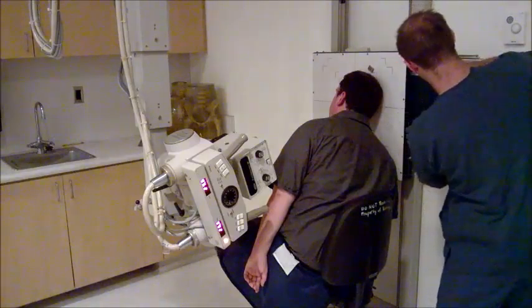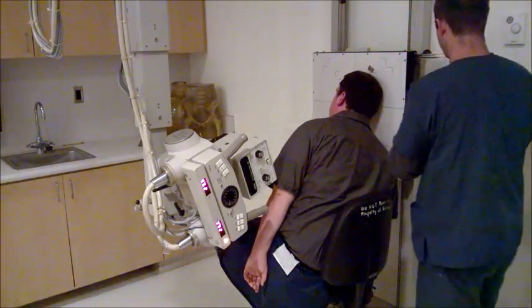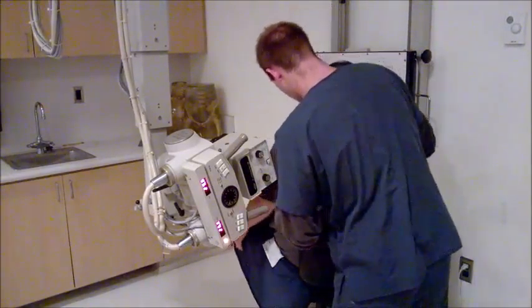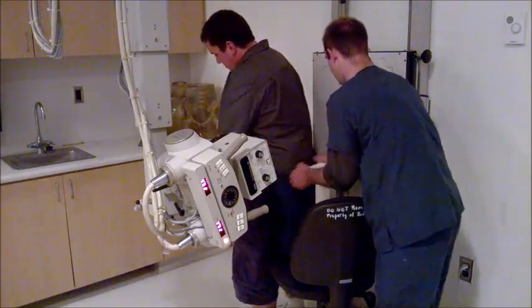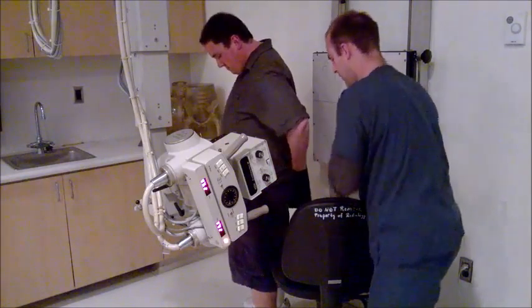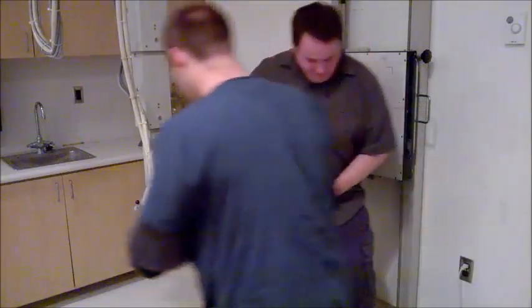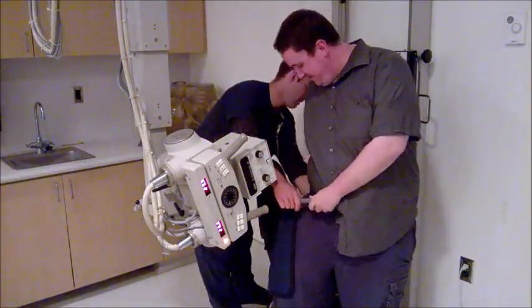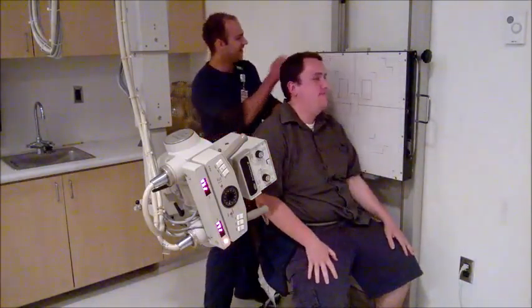I'll come back here, put a new cassette, of course 8 by 10 lengthwise. And sir, I'm going to need you to get up and let's put this onto your right side. There we go. Perfect. Right here, sir. All right, now you're going to be facing me right now. There you go, sir. There we go. It was right up there, huh? Alright. Yeah.